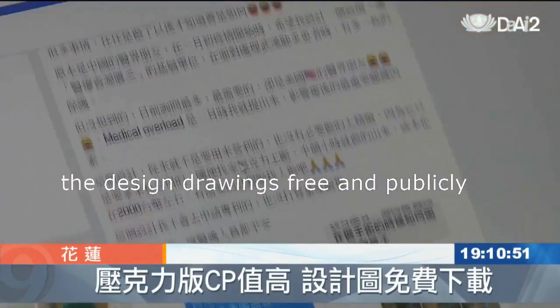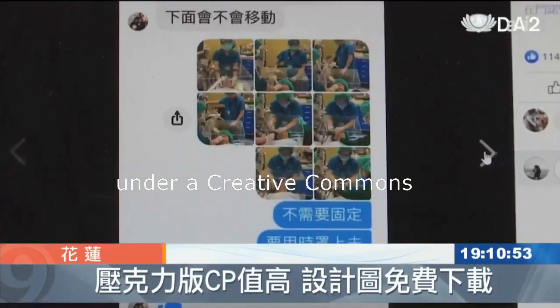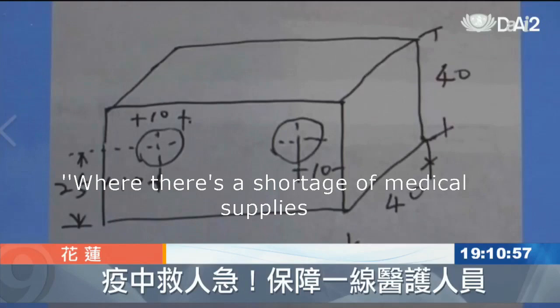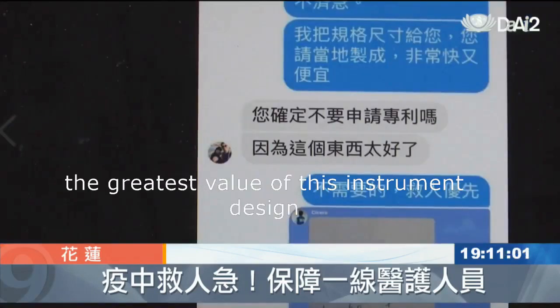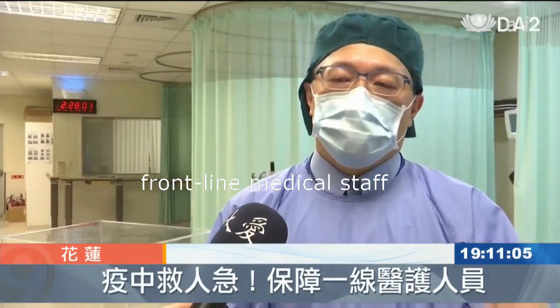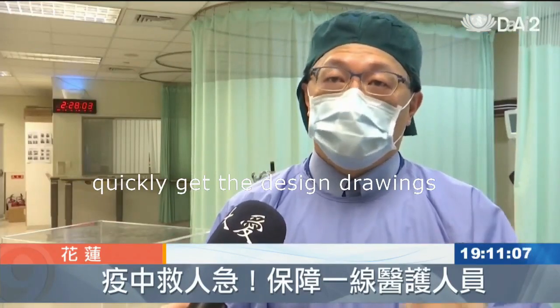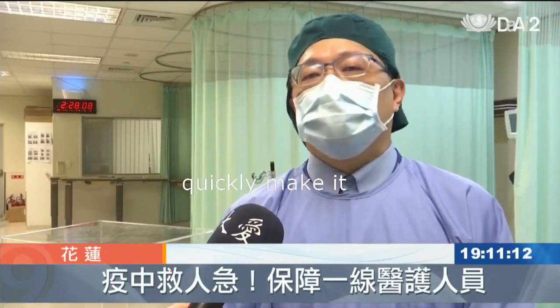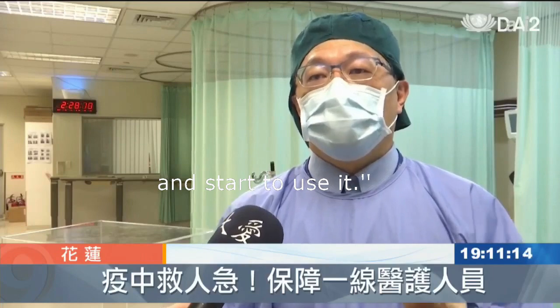Dr. Lai has made the design drawings free and publicly available on the internet under a Creative Commons Attribution Non-Commercial International License. Where there's a shortage of medical supplies or in overloaded areas, the greatest value of this instrument design is being able to let front-line medical staff quickly make use of this — quickly get the design drawings, quickly find manufacturers, quickly make it, and start to use it.